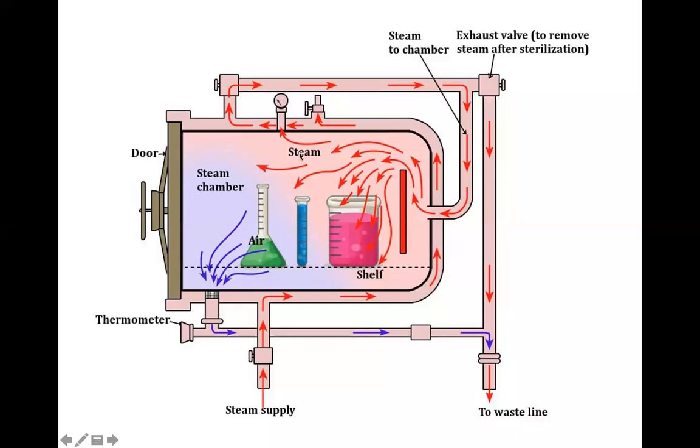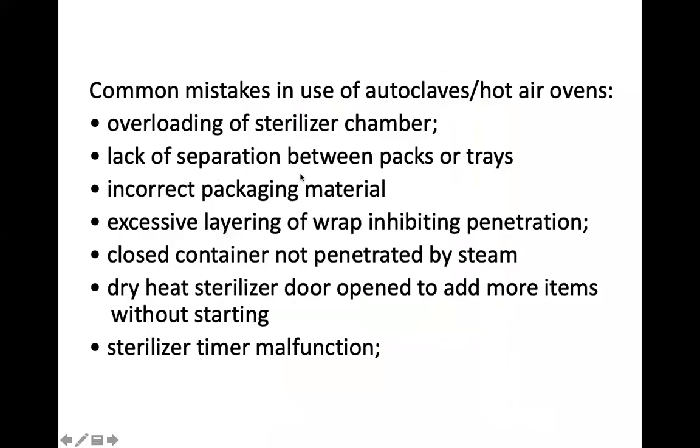Make sure there's sufficient spacing between packages or between items, okay? So, lack of separation between packs. Incorrect packaging material: I keep mentioning cotton swabs, which are commonly used in the lab and even in the hospital setup for whatever processes. Some of these swabs can be wooden sticks. You put a ball of cotton, then you sterilize them. You can make packs of 50 or 100 and then you wrap them.